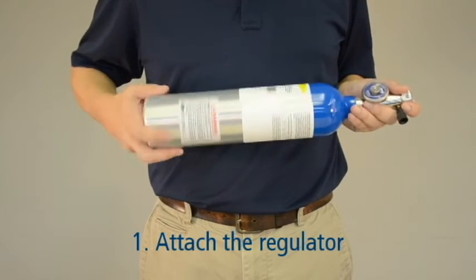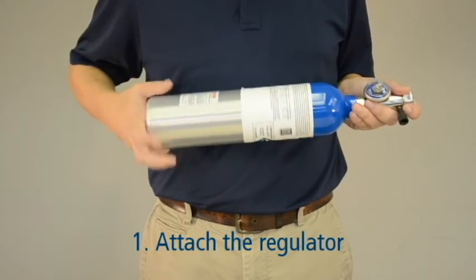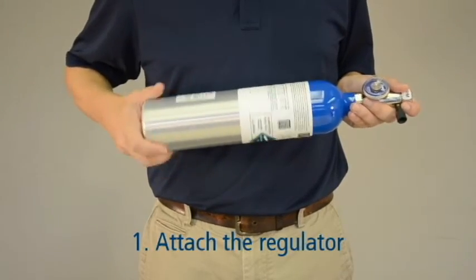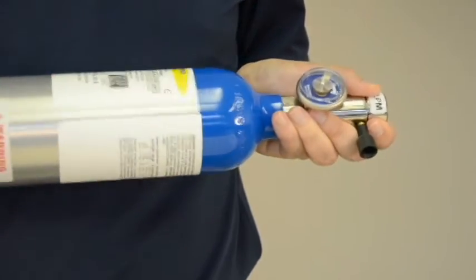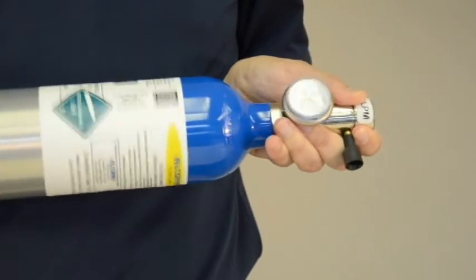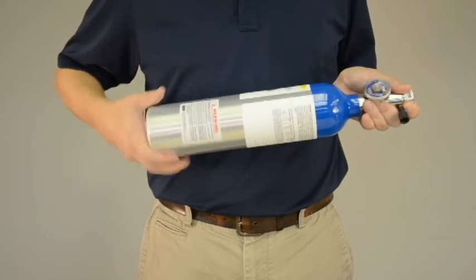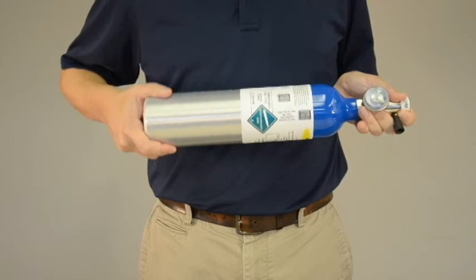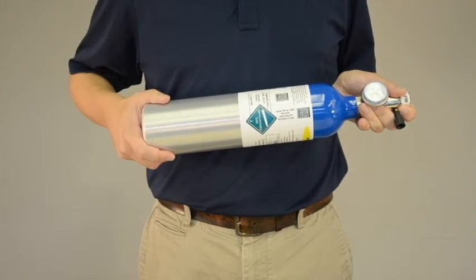For safety purposes, point the regulator end of the canister away from your body and away from others. Twist the regulator securely in place, making sure you don't over-tighten. You may hear a pop or a hiss sound as you tighten the regulator. This is normal.